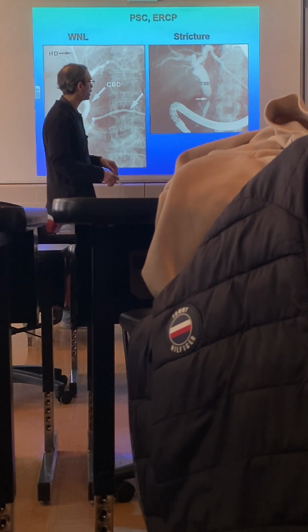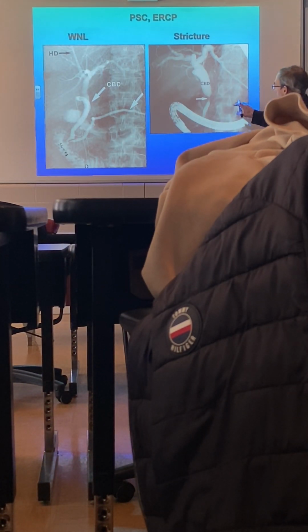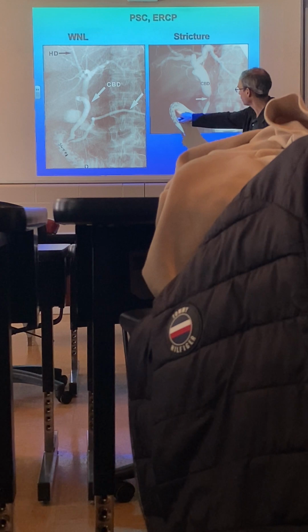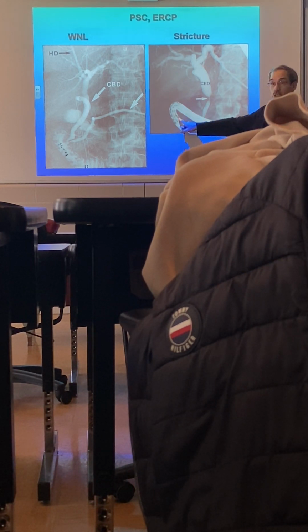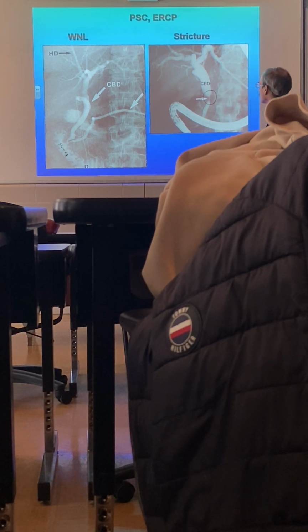However, here's an example of someone with primary sclerosing cholangitis. Something very similar occurs with acute cholangitis. And again, you can see this is the endoscope right here that's used to inject the tree. We've got some retrograde flow of the dye here going back into the biliary tree. You can clearly see that we do have a strictured area in the biliary tree.